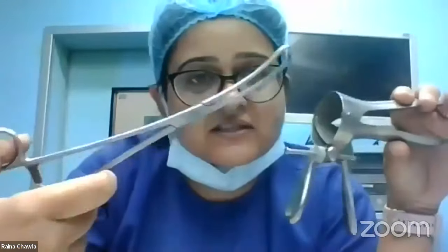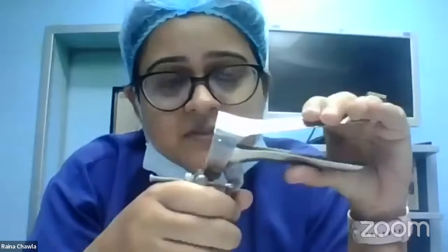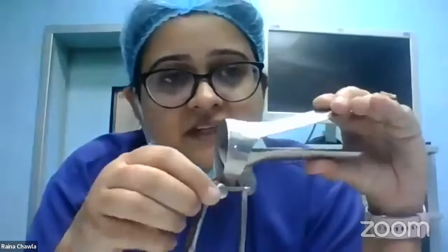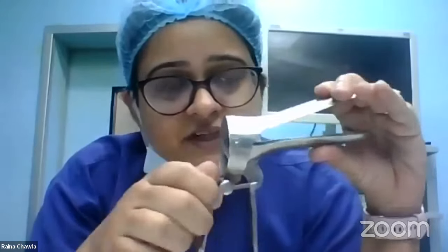Like when I'm doing a DNC or an endometrial biopsy, one instrument will hold the cervix. This is a Auvard's, we'll discuss this. And then I don't have much space to maneuver other instruments. So its use is limited. What are the uses? It is used for taking a pap smear. It is used for removing an intrauterine device. It can be used for taking a punch biopsy on the cervix. But other than that, it has very limited uses. You can't do DNCs and you can't use it for vaginal hysterectomies.